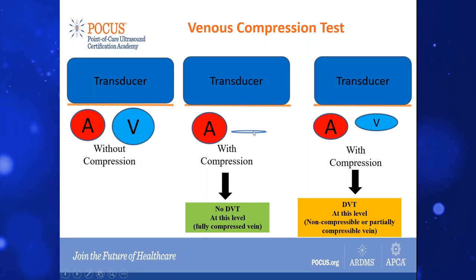If it does not collapse, you're either not putting enough pressure, or there's a clot present. Sometimes you may actually see the clot inside the vessel, but at times you may not even see it — there could be a lot of artifact in the area, which makes it difficult to determine that.